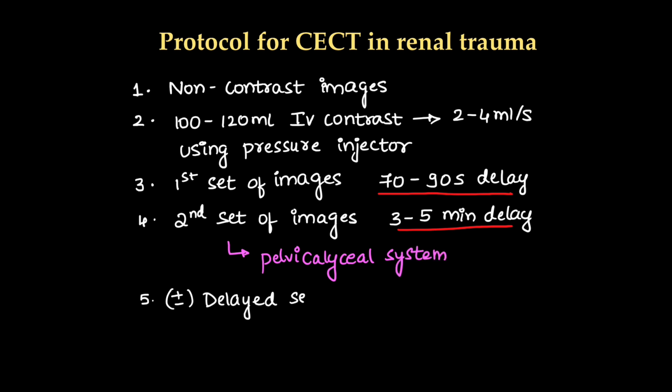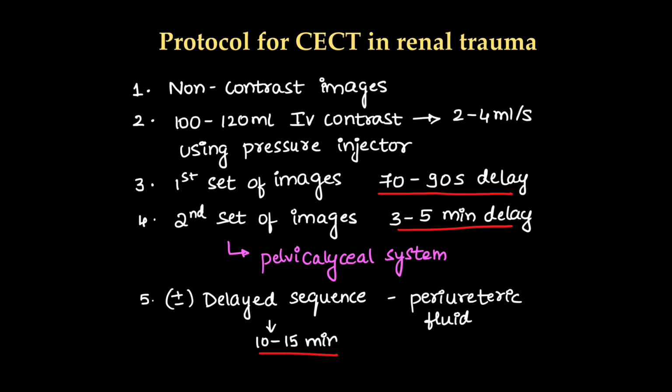Next, we may or may not use a delayed sequence which can be taken to rule out any periureteric fluid. This is taken at 10 to 15 minutes after the contrast. Now to AAST grading. AAST stands for American Association for the Surgery of Trauma.